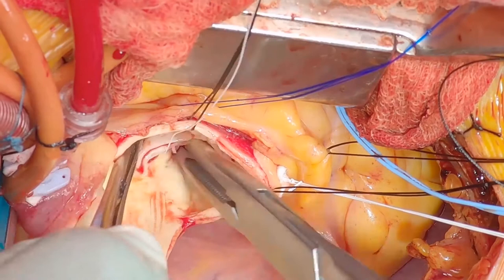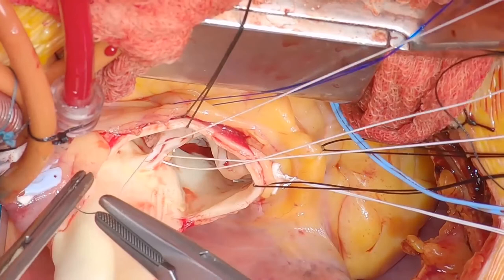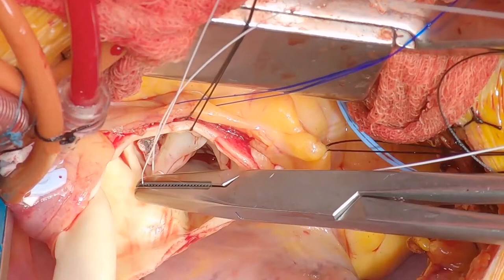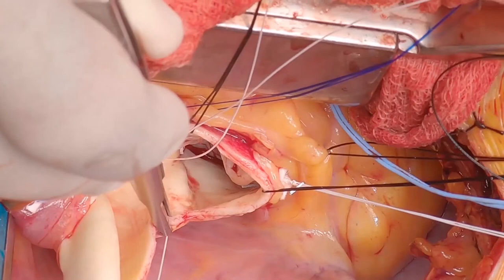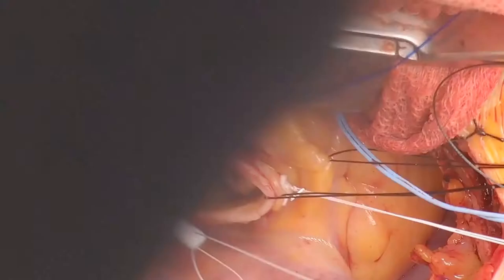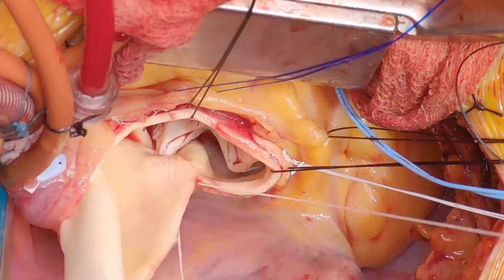Then we go to the non-coronary left commissure — same thing, hitching it up to increase the approximation of the leaflets. Depending on whether I think there needs to be slight adjustment, I might place this off to one or either side when I tie it down to pull the leaflets in a certain direction. Here you see I've pulled it slightly towards the non-coronary sinus with both figure-of-8 suspension sutures, which tucks it in at a higher level with a lot of height of approximation of the leaflets.